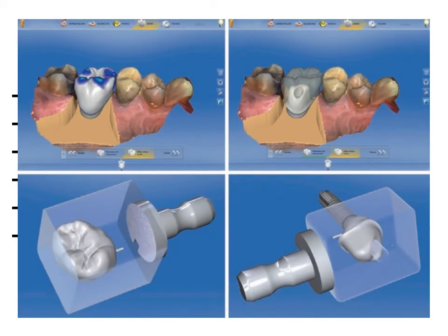And there is a subsequent module for implants, the implant prosthetic module. This type of module enables the design of customized abutments and prosthetic frameworks for both cemented and screw-retained implant-supported restorations. To be able to design these implant prostheses, the CAD software includes a library of different types of implant connections and scan bodies for digital impression that can be updated with new designs as they are introduced to the market.